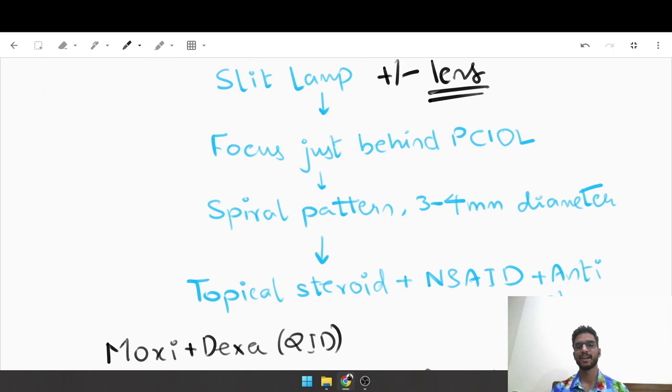How do you know? There are indicator markers - red color indicator markers that you can see in the ND-YAG machine. Either these will be just two or these will be four, and the moment these appear the sharpest is the point where the laser beam is focused on the posterior capsule. You follow a spiral pattern instead of randomly, discreetly placing those laser beams, for the simple reason that a spiral pattern helps in a controlled delivery of energy and prevents the vitreous prolapse into the anterior chamber.